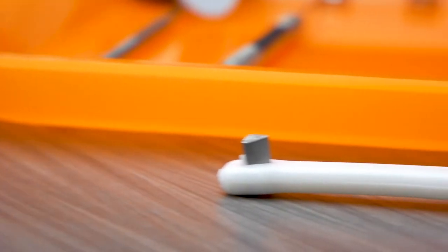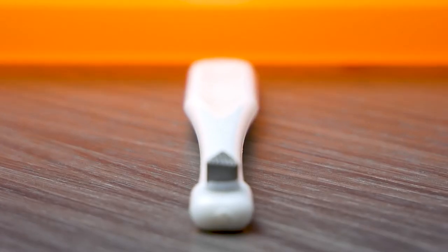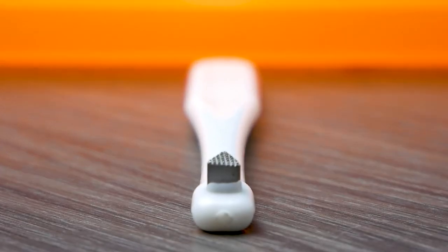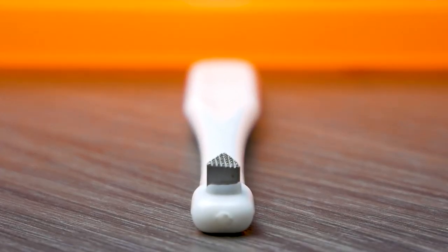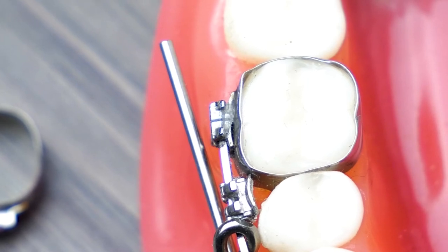A bite stick is commonly used to help seat the band. The metal part of the instrument is placed over your bracket. Then the force of you biting down will help push the band into place.